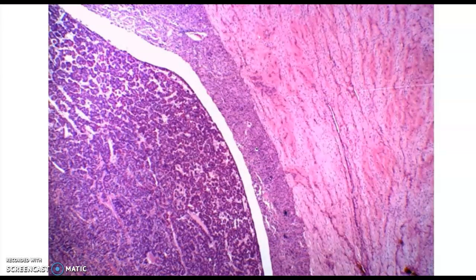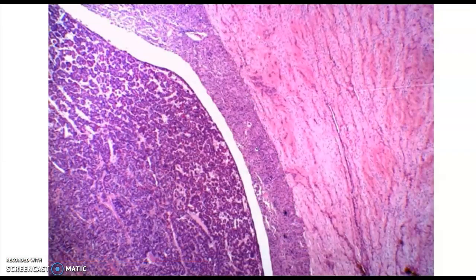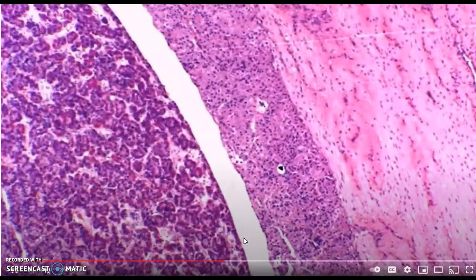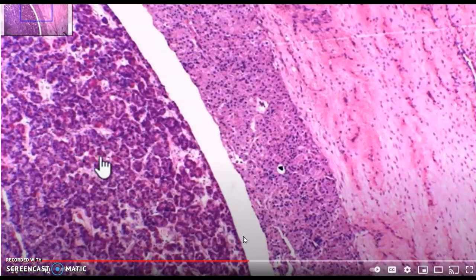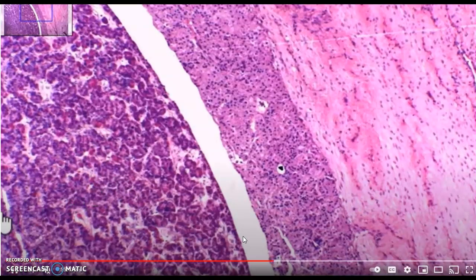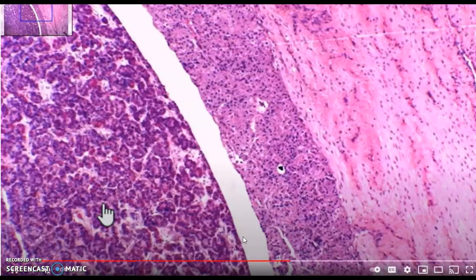And if we zoom a little bit, after this, we're gonna check here over the adenohypophysis. We're gonna check here these little blotches. It looks like glandular tissue. This is your anterior hypophysis, the anterior pituitary gland, and they produce several hormones, such as the growth hormone, or the thyroid stimulating hormone, or the adrenocorticotropic hormone, or the luteinizing hormone, or the follicle stimulating hormone, and prolactin. And they are huge hormones, major hormones.